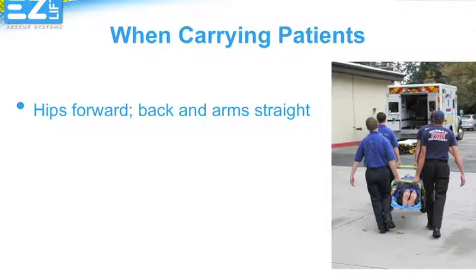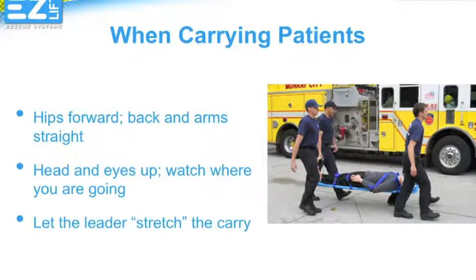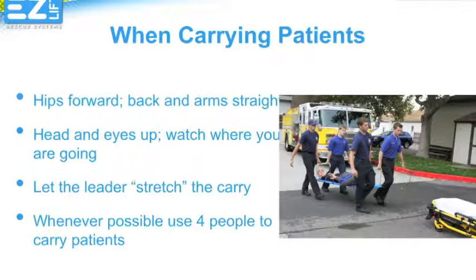Whenever possible, use four or more people to carry the EasyLift Rescue System. When carrying, make sure you keep your hips forward — leaning your upper body forward will increase the load on your back. Keep your head up to watch your partner and where you're going. Allow the leading person to stretch the carry; it should almost feel like they're pulling you along. Again, when possible, use four or more people to carry patients.